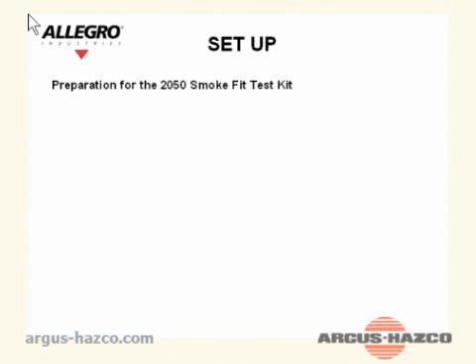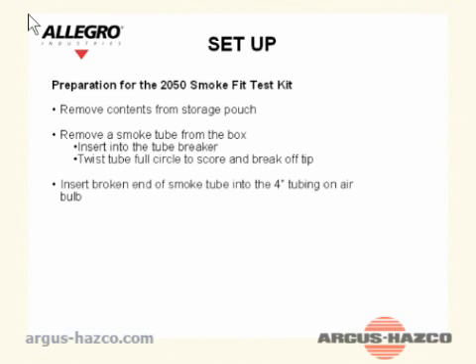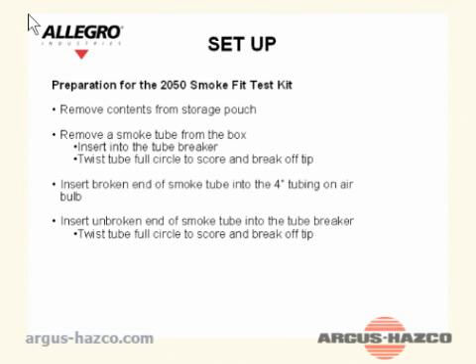Setup — Preparation for the 2050 smoke fit test kit: Remove the contents from the storage pouch. Remove the smoke tube from the box and insert into the tube breaker. Twist the tube full circle to score and break off the tip. Insert the broken end of the smoke tube into the 4-inch tubing on the air bulb.